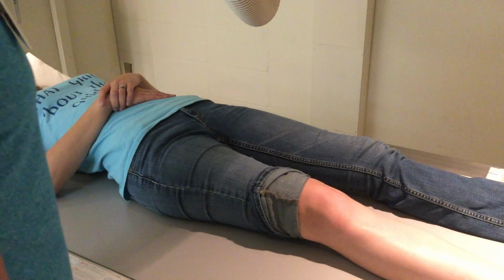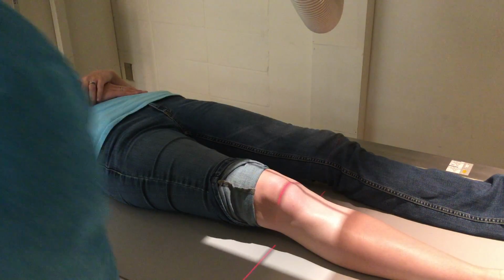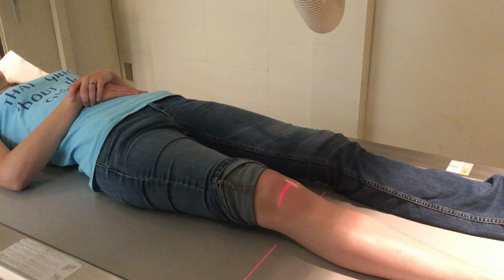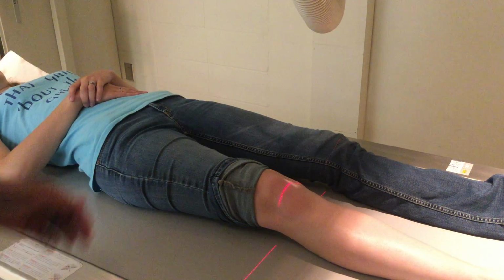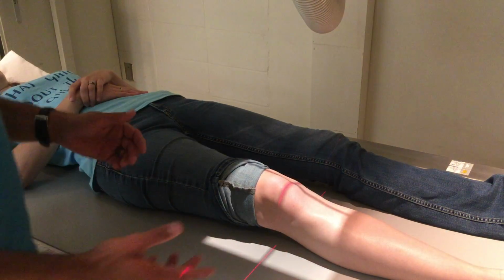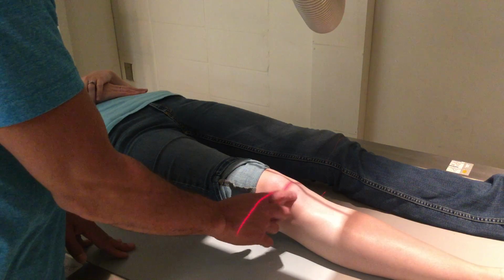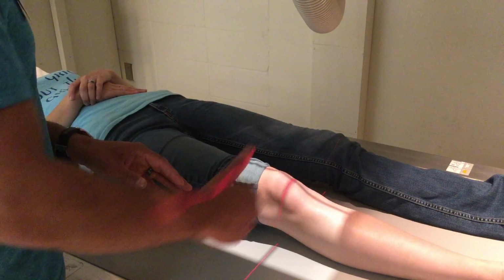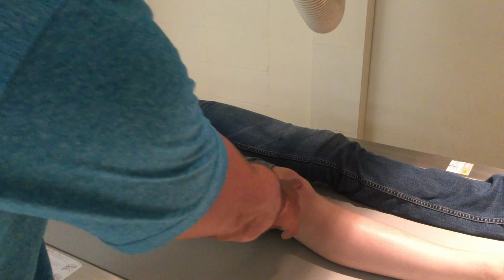And I'm gonna move some stuff. I'm trying to stay within the range of my camera. I like to mark inside on the bottom, but you can also do it here on the table. So we'll do it on the table so you can see it. All right, so you center the middle of the knee about an inch distal, or a half an inch distal, to the patellar apex. Put your foot straight up and down. You need the leg nice and straight. The apex of the patella is at the bottom of it.